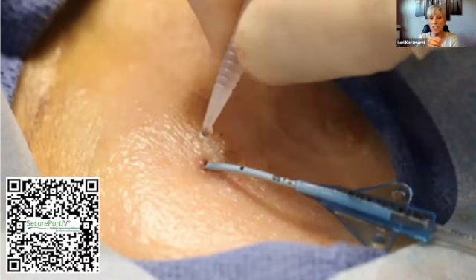So hopefully that answers your question. I tell people all the time, we tend to want to overthink it. It's an adhesive, a different type of adhesive than what we already have on our dressings, but this is an opportunity to be a barrier for microorganisms as well as help the dressing stay on.